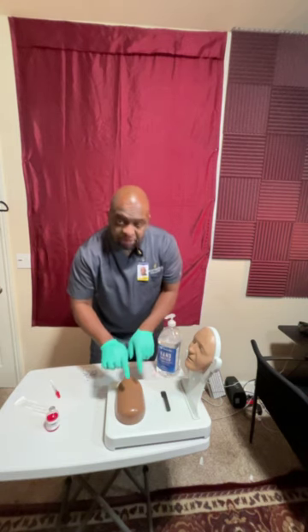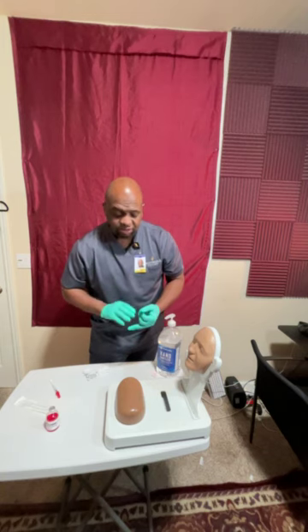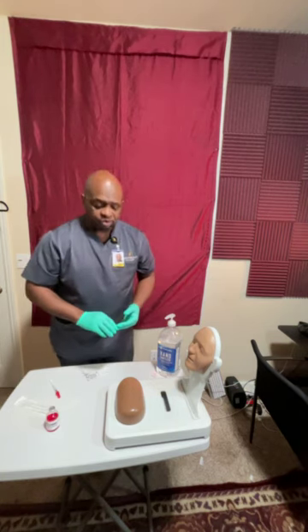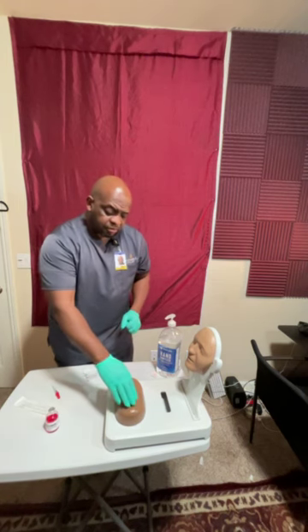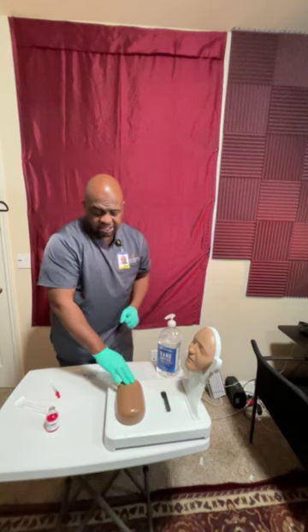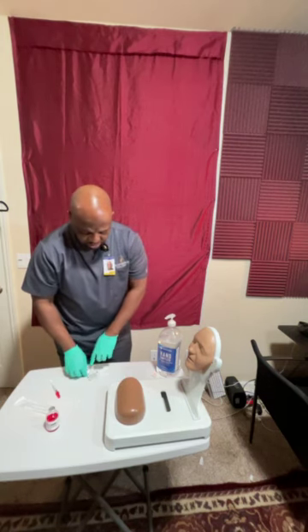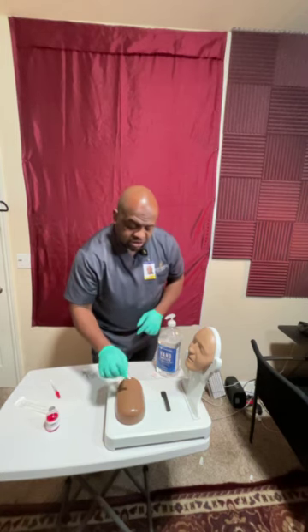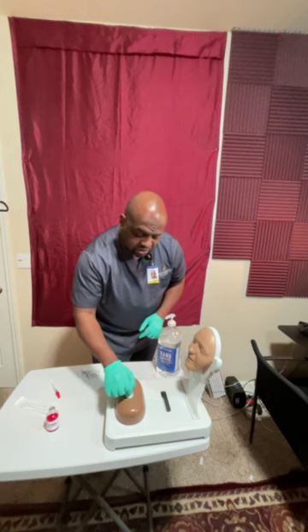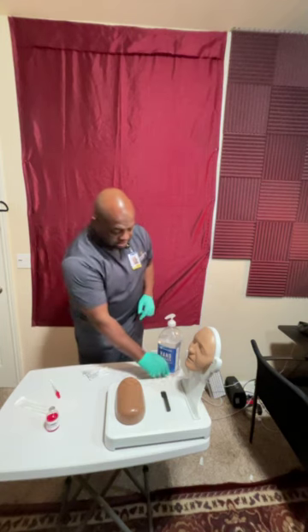First thing I'm going to do is inspect the area. I'm looking for any type of skin irritation, any type of discoloration, or any redness. Then I'm going to palpate, feel around, making sure there's no tenderness at that site, right? Everything looks good there. Then with my other alcohol wipe, I'm going to wipe the site, from the center in circular motions from 2 to 5 inches outward, right? We're going to go circular, outward, okay? Want to let that air dry. Let's get rid of that there.